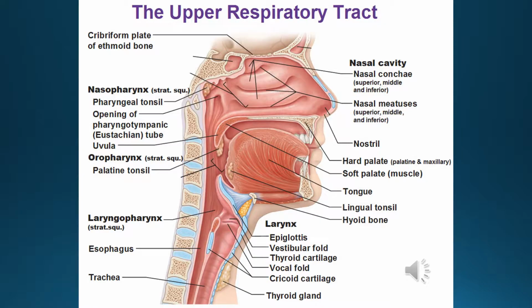This slide is the anatomy and physiology of the upper respiratory tract, looking at this from the intubation standpoint. If you use a curved blade, which is a Macintosh blade, you want to identify the epiglottis, which is labeled in blue, and the pink just above that notch, that is the vallecula. You want to insert that blade into the vallecula and lift up and towards the toes, and that provides a direct view by pulling the epiglottis up.